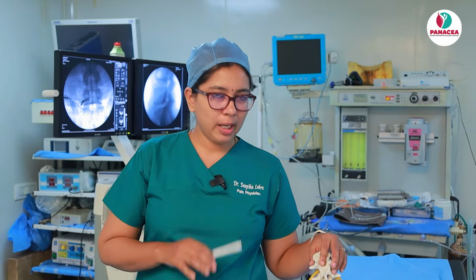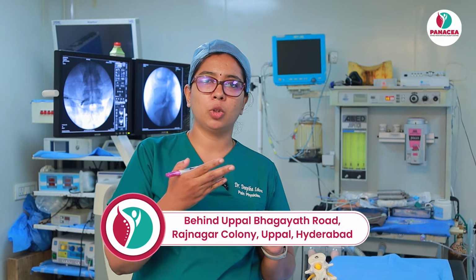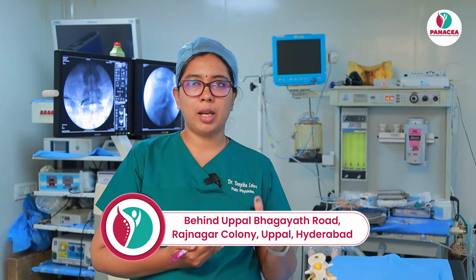It is very near to the nerve and you might hit the nerve. Very high chances of it will be there. So it is not a safe triangle. It is just a misnomer. Mainly what we are going to do is approach the epidural space just below the pedicle. The pedicle will be at the 6 o'clock position. We will enter into the epidural space and give the injection to relieve the pain of the patient.